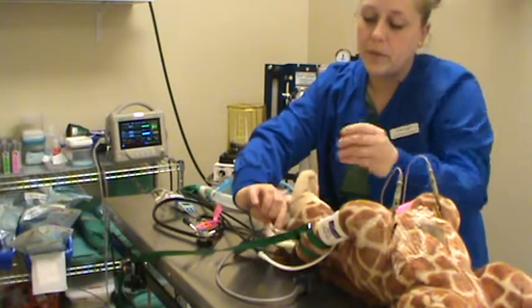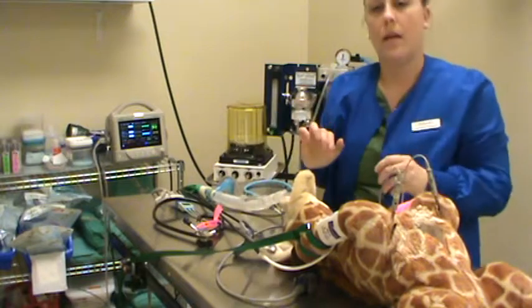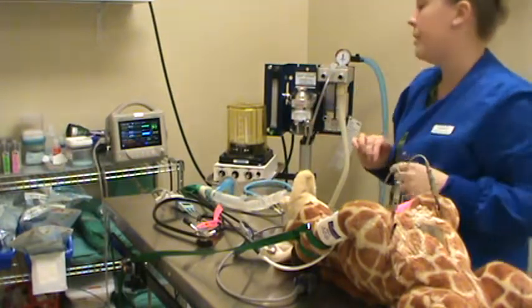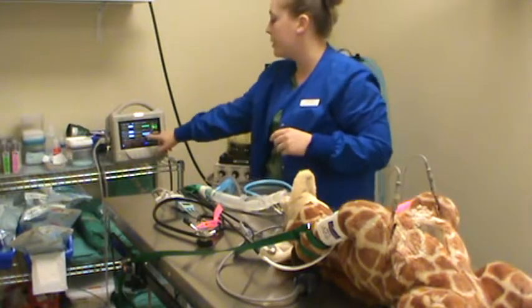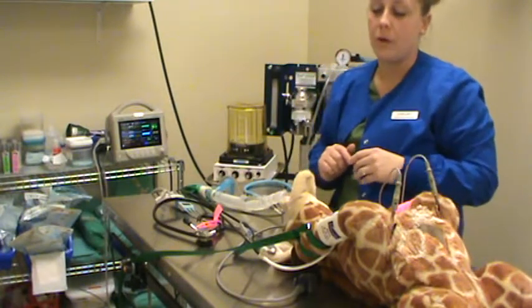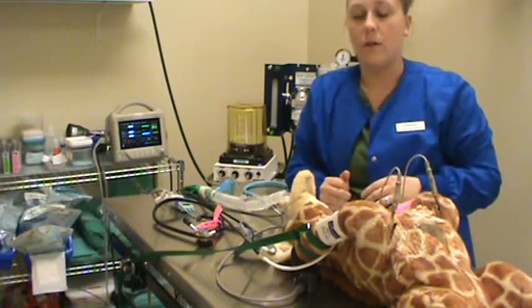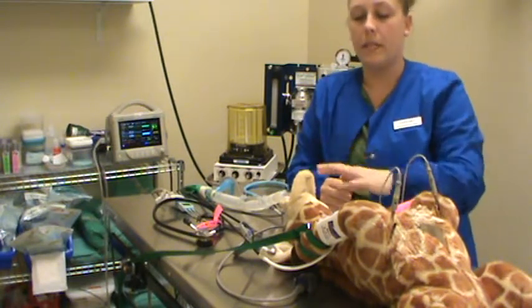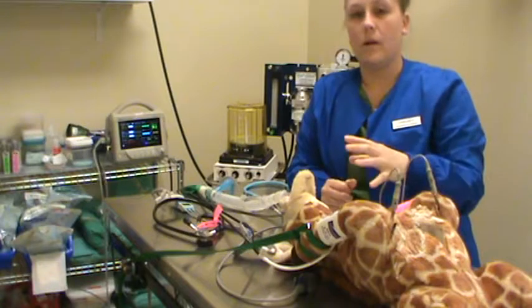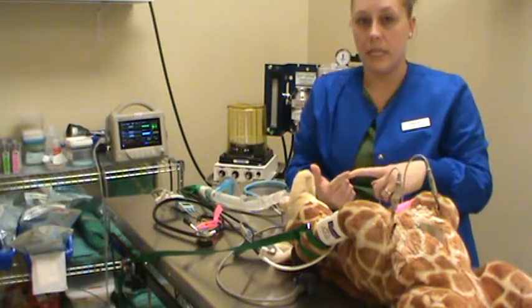So we're going to clamp that on. So the white little side of that clamp goes on the underneath, and that would give us our pulse ox reading. So SpO2 here is going to give you a good reading of how well the patient is perfusing their tissues. So how well they're oxygenating. If we're ventilating them properly, they're going to be really well oxygenated. So the second part of that is our mucous membrane color and our CRT.